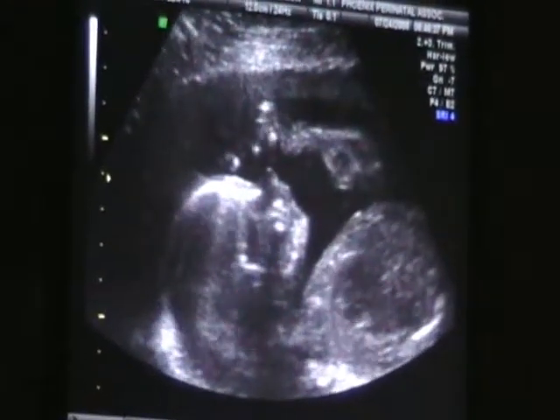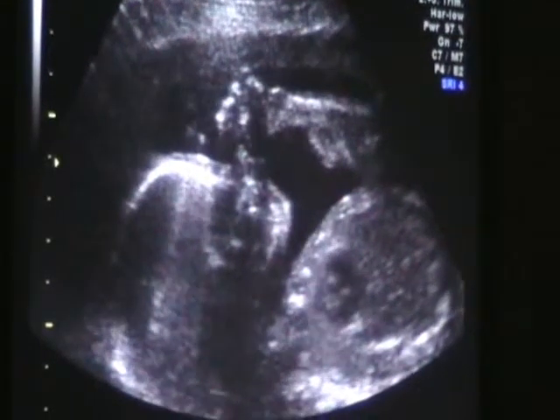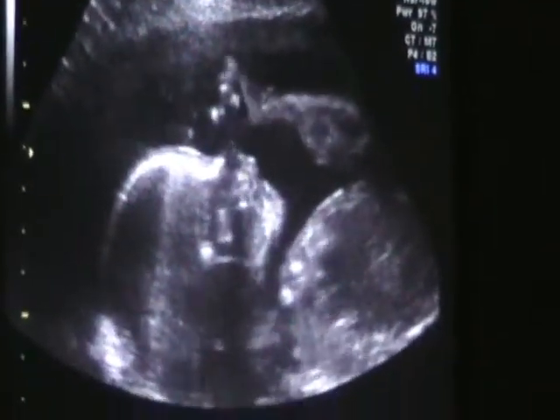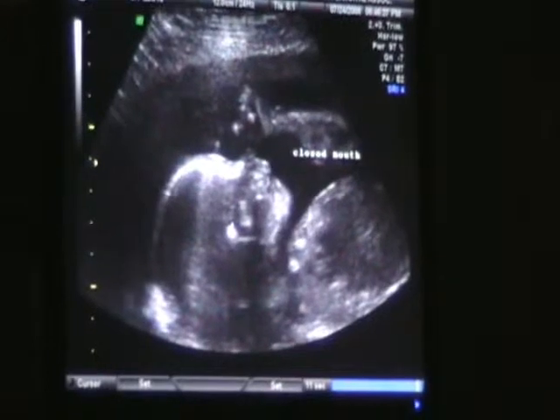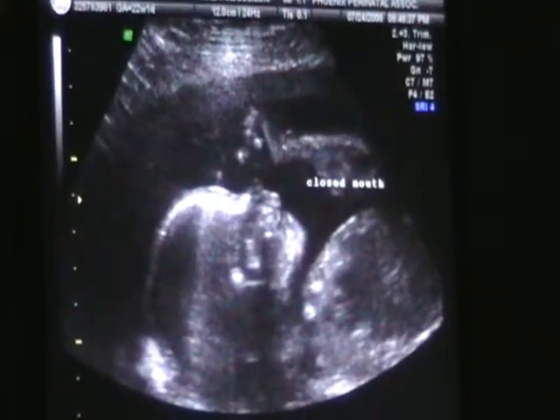Now she's going to open her mouth here. Watch. She goes down right here. There it is. So that's the very back of her jaw — that's what you're seeing.